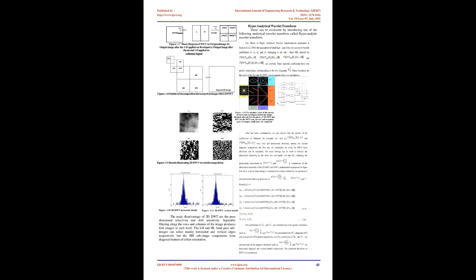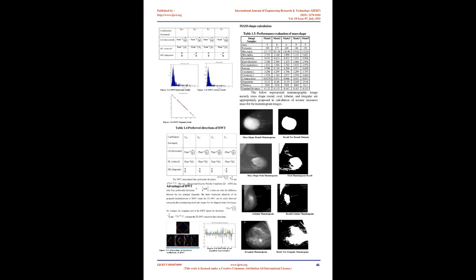However, this central idea breaks down at the edges of a picture. In this context, edges refer to those points on a picture where there are discontinuities or sharp contrasts between a pixel's content and its immediate neighbor. The bilateral filter accounts for the edges by weighting pixels based on their photometric similarity in addition to geometric proximity. Proposed adaptive hybrid bilateral filter.